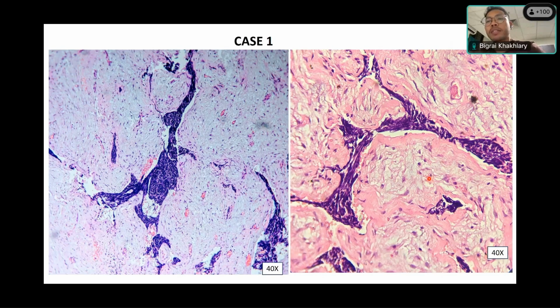Neurofibroma. Okay, neurofibroma. Well, how do you account for these blue cells in a neurofibroma? These blue colored cells showing crush artifact. You don't get this type of cells in a neurofibroma. Anything else? Dr. Jasleen had told another differential. What was that? Ewing-like tumor, and she had also mentioned Ewing's, isn't it?